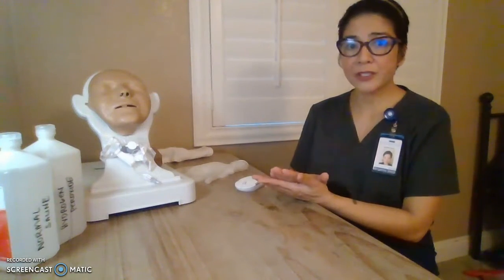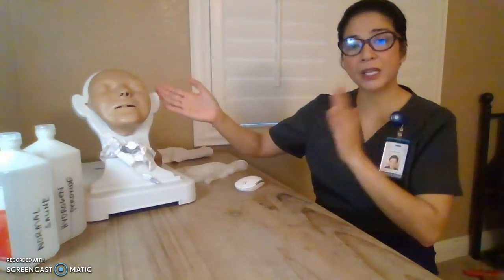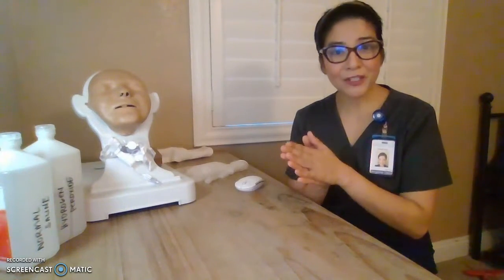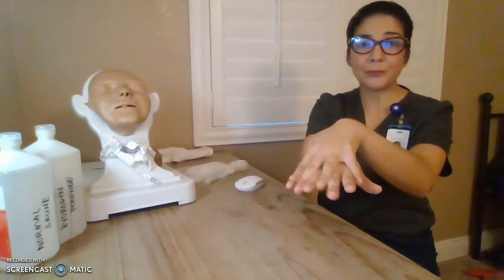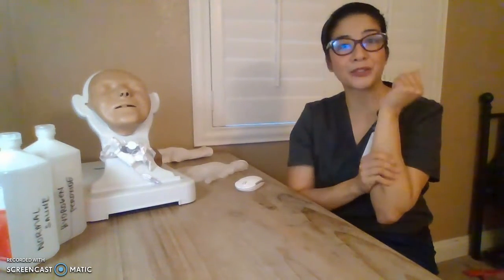So for any procedure, I just want to remind you, let's not forget our patient identifiers, our patient privacy, and of course good hand hygiene. You'll be donning and doffing gloves throughout this procedure, so make sure you do that in between. This procedure also requires a sterile step, so mind your sterile field, have your hands free from any jewelry, and roll up your sleeves.